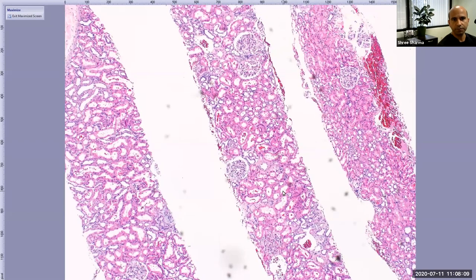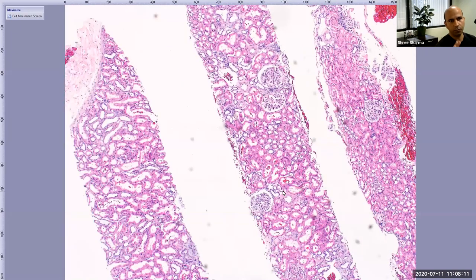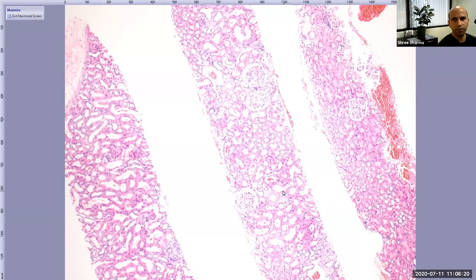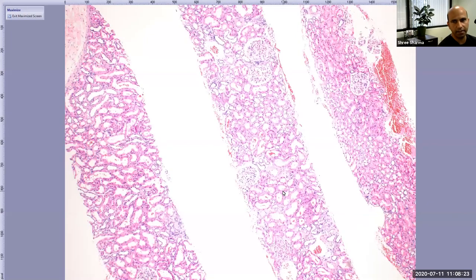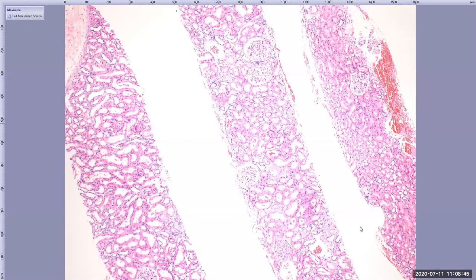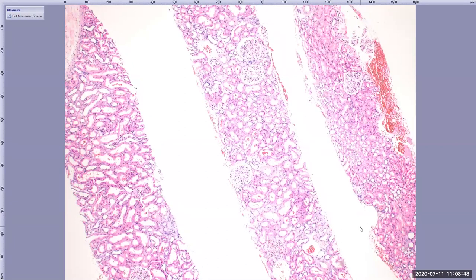As I move to higher power, the field of view changes. Low power is used for identifying the basic architecture of the kidney. As soon as I put the slide under the microscope, I confirm whether I am looking at the kidney or not. These round structures visible on low power, which look like soccer balls, are known as glomeruli. In the background there are a ton of tube-like structures.